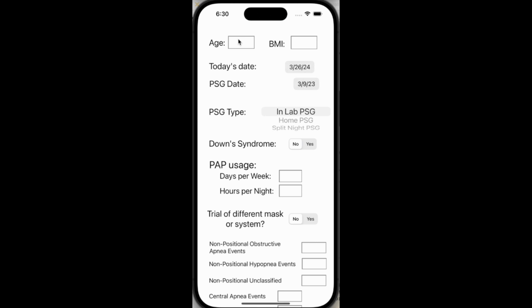This is an example of the results that can be provided. The app provides general information or recommendations about the workup that can be done prior to evaluation by an otolaryngologist, as options include updating a patient's prior sleep study or considering referral to weight management. Implementation of the app in your practice can potentially improve the number of patients who present to otolaryngology clinic with a completed and up-to-date workup for further evaluation of a surgical adjuvant for obstructive sleep apnea.